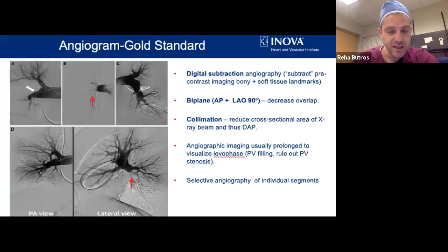So the pulmonary angiogram is the gold standard for the diagnosis. It gives a very good detail of the peripheral lesions that are not otherwise well seen with the CT angiograms. And we also do the crucial hemodynamic assessment of the right ventricle, the right atrium, and the pulmonary arteries when we're across the chambers before we start the angiograms. These are some sample images.